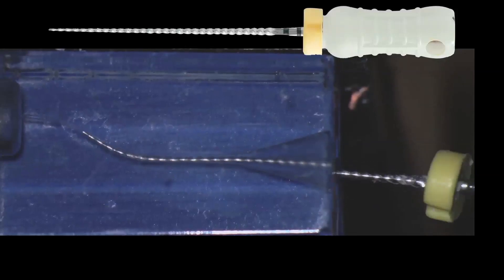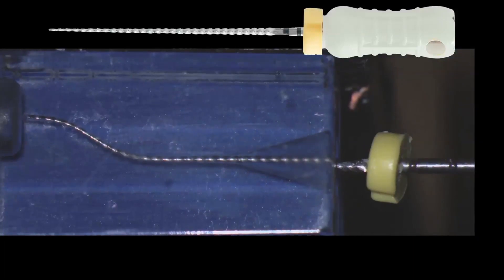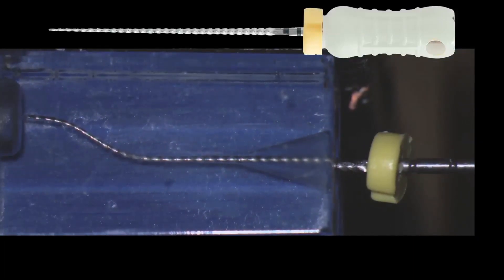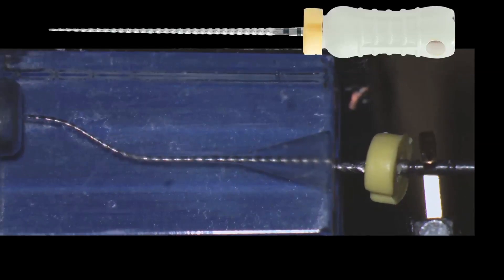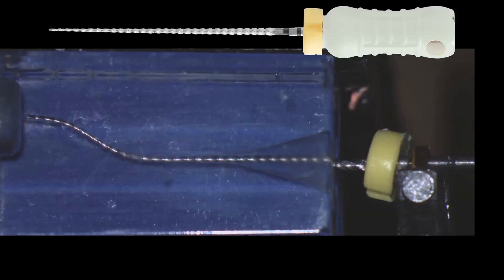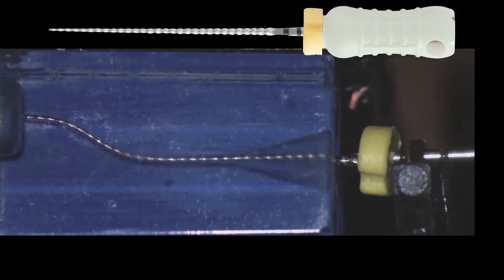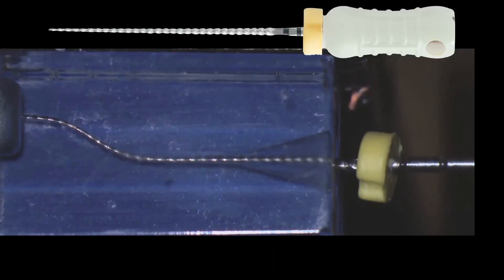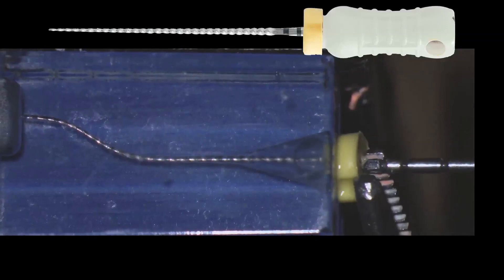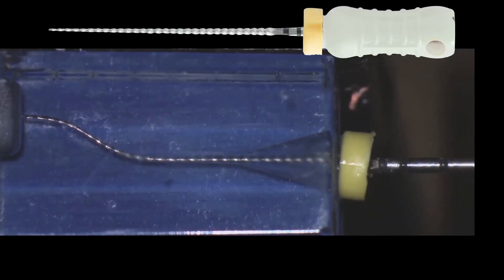Now we establish that working length. Here you can see the instrument is very tight — we are almost at working length. We attach a clip for the apex locator. You are going to start hearing a beep when it gets to the apex. That means we have achieved that vertical dimension with the electronic apex locator. We will adjust the rubber stop, take the file, and now we have acquired the working length. We measure and record that. We will irrigate — remember that every file that comes out of the canal requires irrigation.